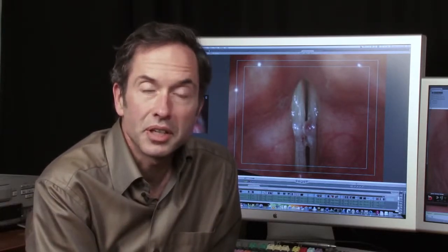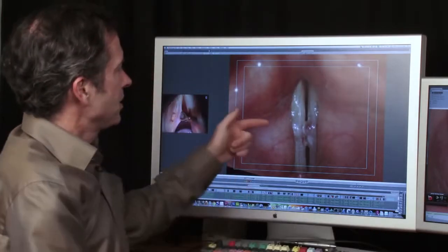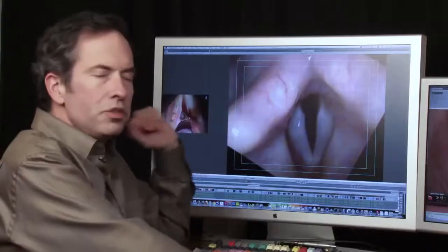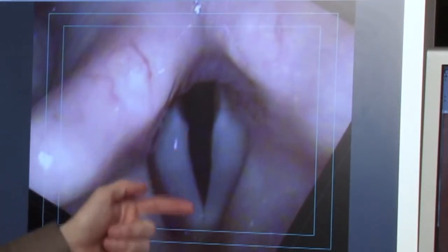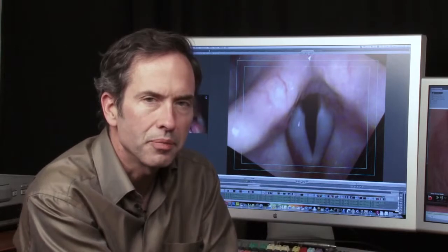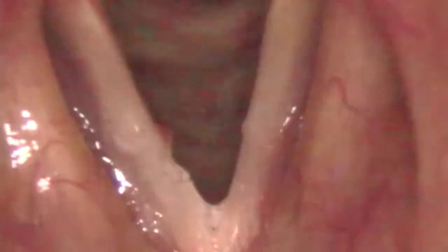Today, I'm going to cover a case study of hemorrhagic vocal cord polyps. That is, bumps on the vocal cord that have blood in them. First, in case you've never seen a vocal cord, we're looking down from above, fronts here, backs here. This is the right vocal cord, and you can see that the edge of the vocal cord is smooth. Now, smoothness is important so that when the vocal cords vibrate, they make a clear sound. Anytime there's a bump on the vocal cord, it's going to disrupt the sound.